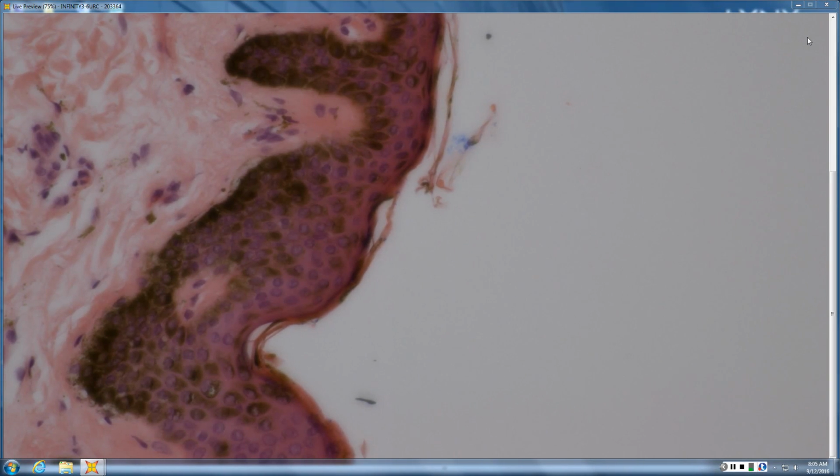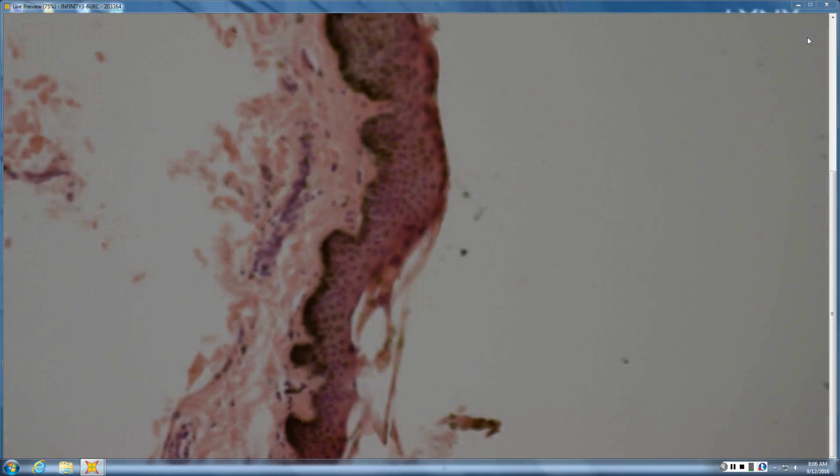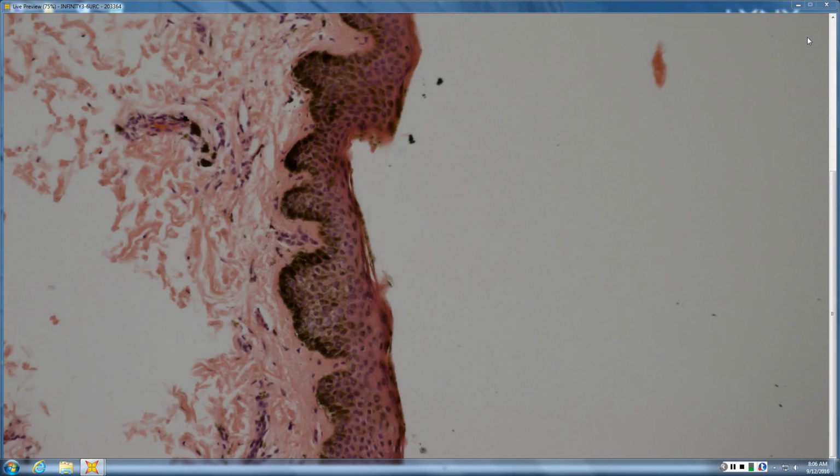So the clinician took it off, and didn't really think it was melanoma because the pigment looks so thin. It looks almost like you could scrape it off, which you can a lot because it's in the corneum. What you see is sharply circumscribed basilar pigmentation all the way through to the corneum, but all within keratinocytes. So, benign ink spot lentigo.